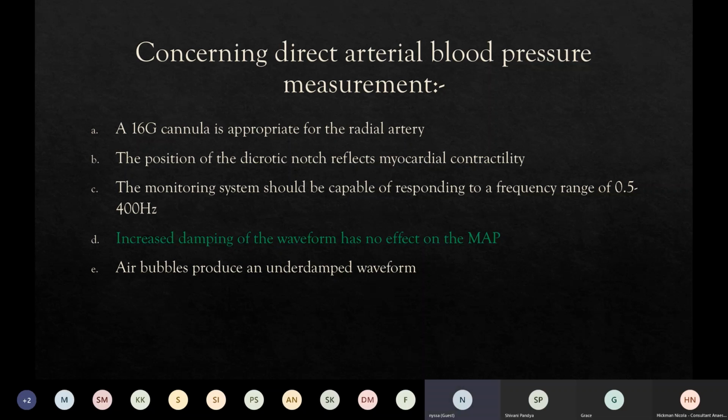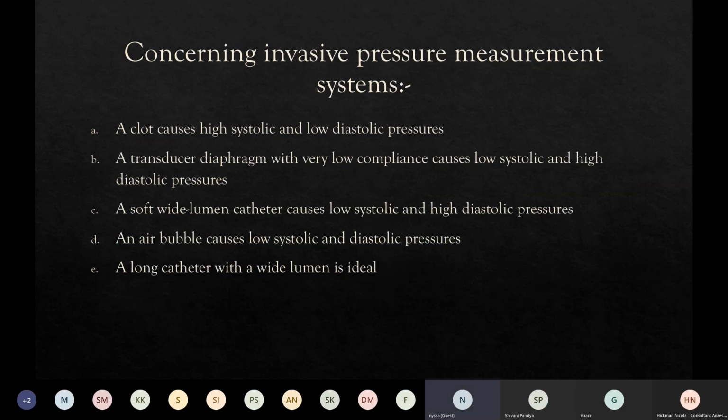And air bubbles do not produce an underdamped waveform. They produce a damped waveform, sorry, not an underdamped waveform, because of the difference between the compressibility of air compared to the column of water that normally should be there. Okay, this is an SBA as well.